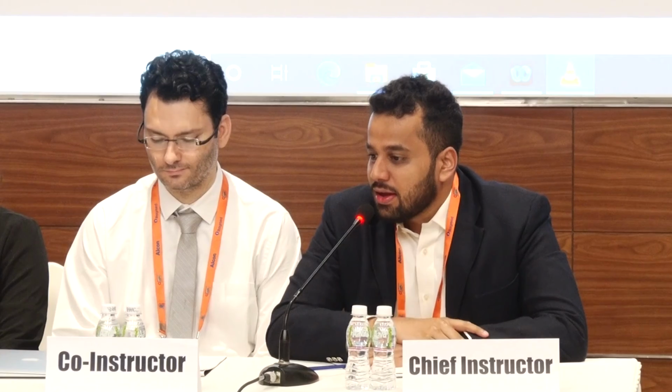Thank you, Tushar. That was really a lovely talk, explaining the evolution of biomechanics over the years. I would like to ask a question to one of our panelists. Dr. Pavitra has worked extensively with the Corvis. I would like to take her opinion whether, as a refractive surgeon, it is absolutely essential in the majority of the cases, or is a Pentacam, a device which gives you both the anterior and the posterior float, good enough with the BAD-D to predict whether a patient should be taken up for refractive surgery or not?